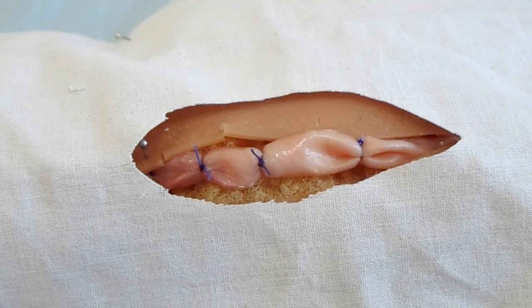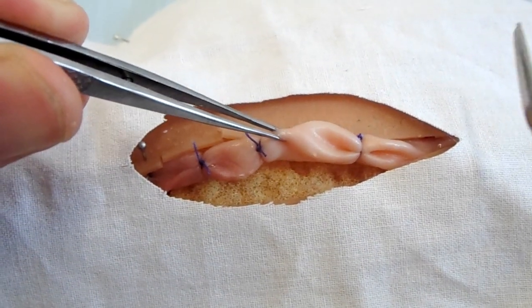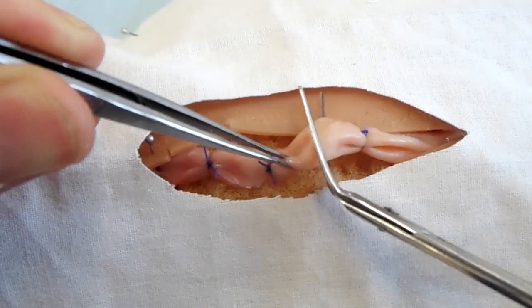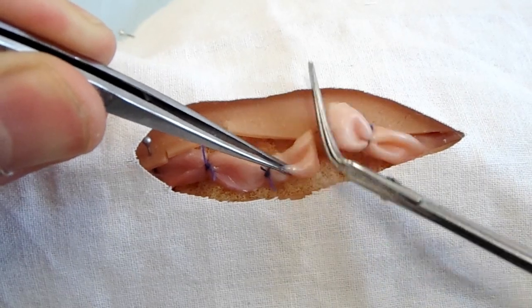After that, the vessel is cut between the ligature with suturing and the ligature in the distal part, to interrupt sympathetic innervation for better function of the collaterals. The vessel is cut.